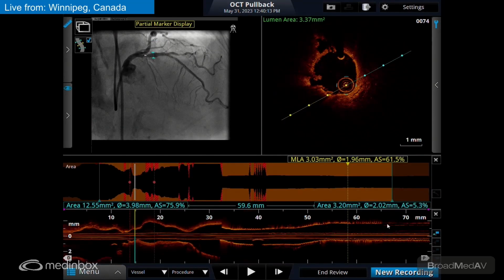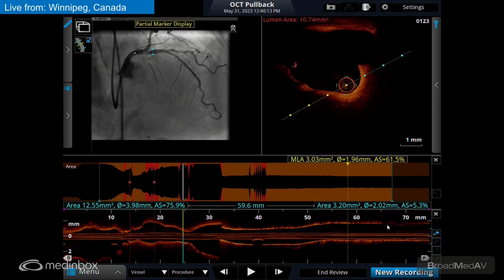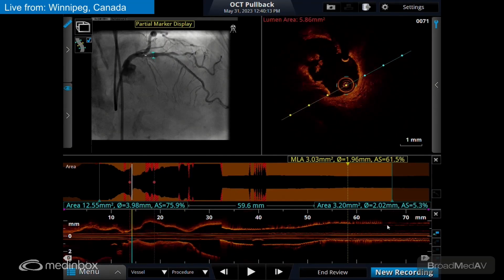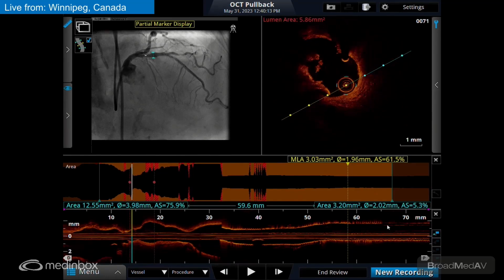All right, let's walk this through here. Left main looks good. Look at that. I think there's a pretty impressive amount of ablation there, compared to what we had before. You've smoothened out your nodule. You've created a circular lumen to a certain extent. Your nodular calcium still comes in around 9, 10 o'clock. Quite impressive. Is there a crack at 12, or is that just a wire shadow?